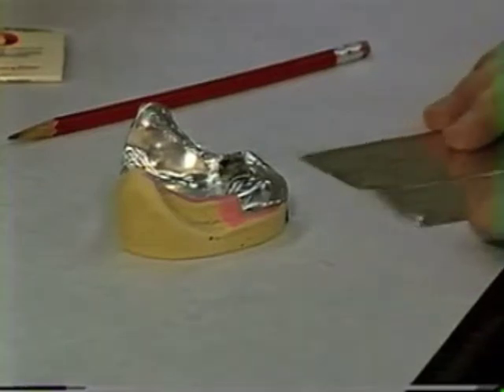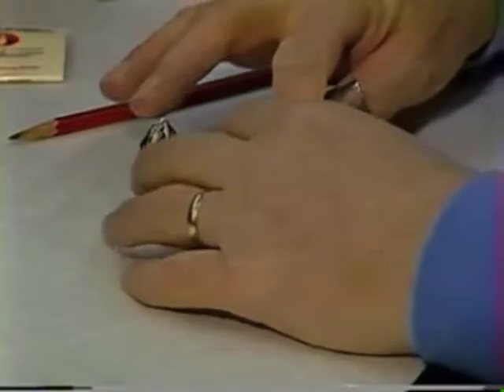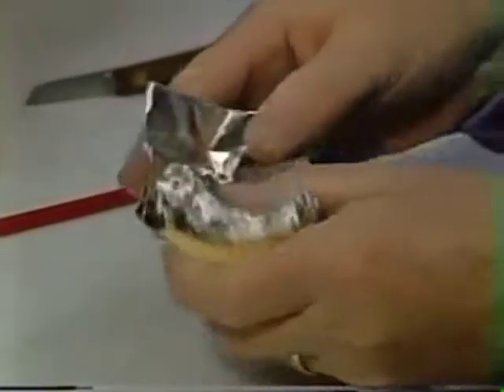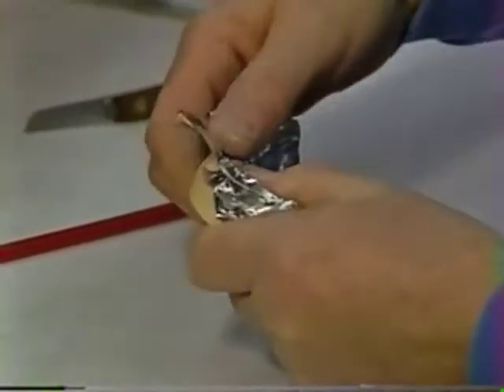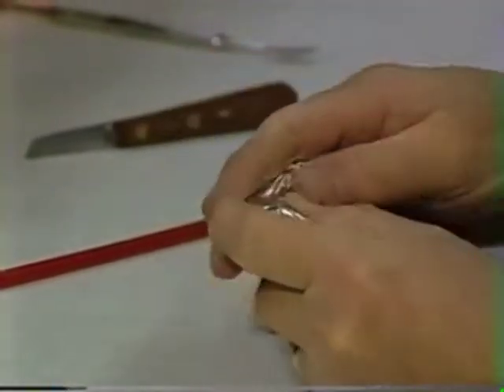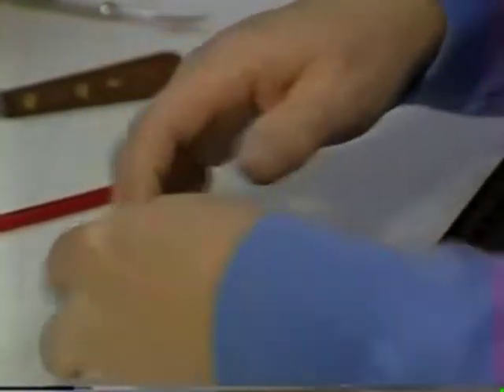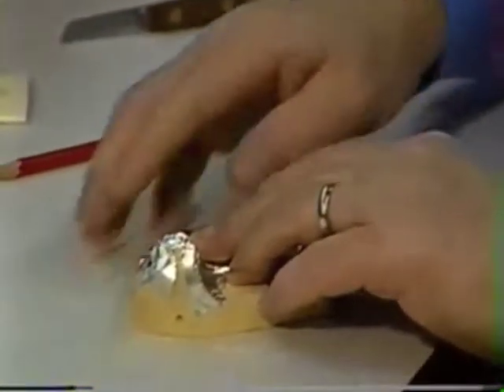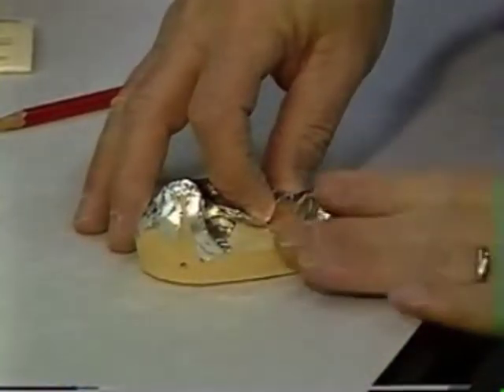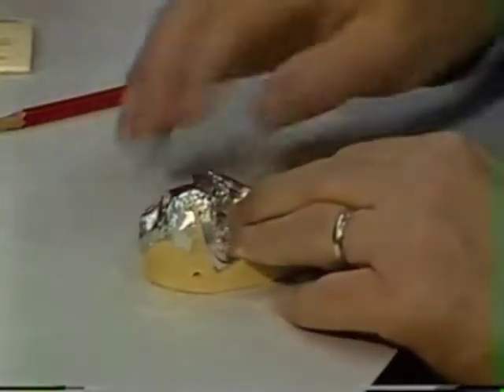So we'll cut a piece now and adapt it to the other side. And again, just adapt it in as best you possibly can. Let the excess come down over the cast, over the vertical walls of the cast. That'll help hold it in place. And you'll have some overlap of it, but that's fine. The overlap doesn't bother you. Just adapt it in very nice and smooth onto the cast like so.